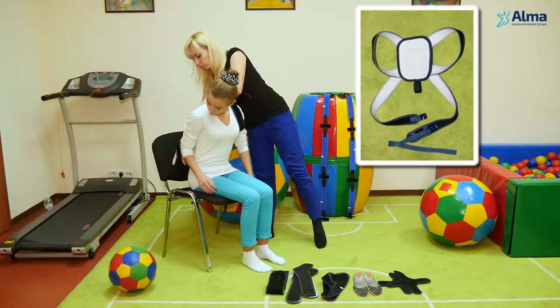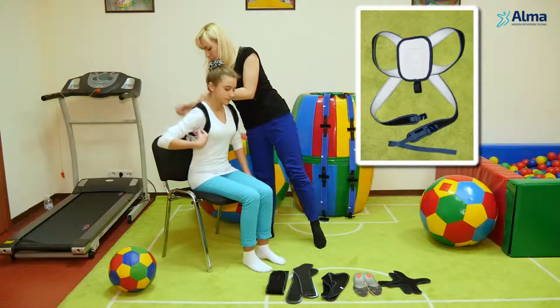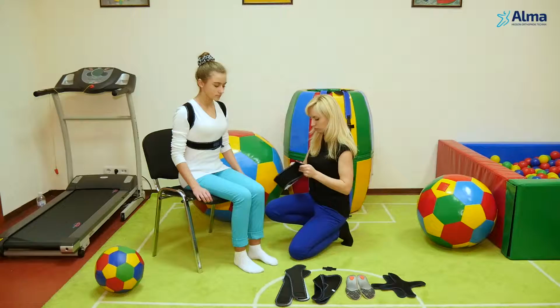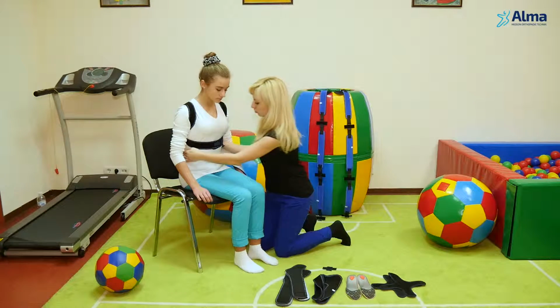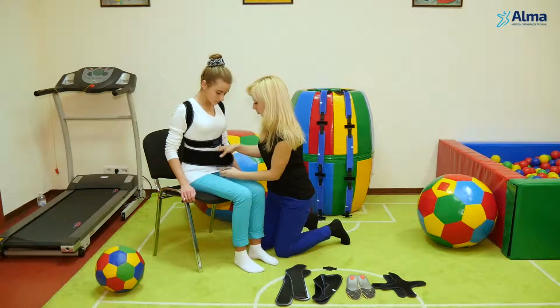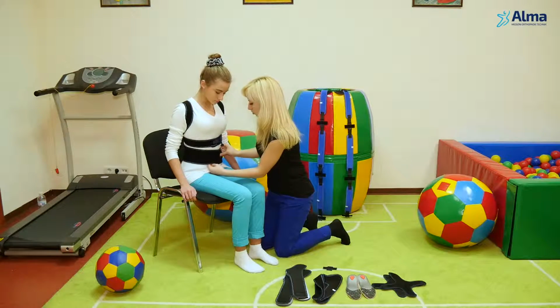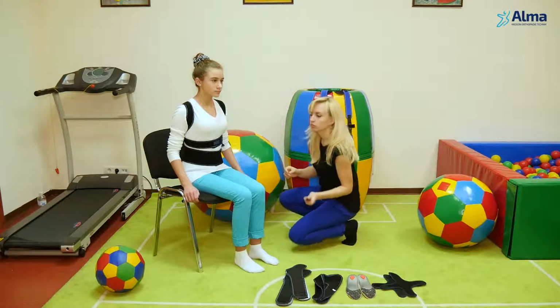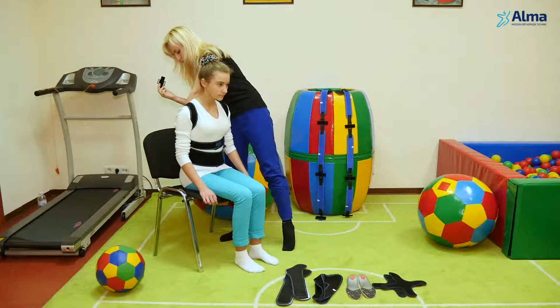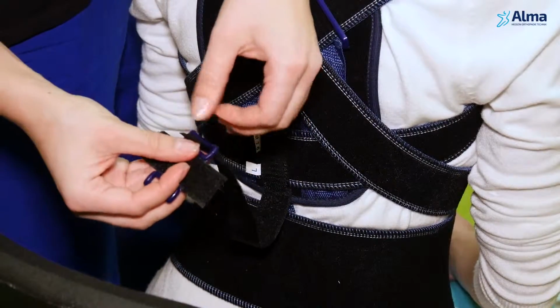When all basic mounting elements are selected according to patient measures and load chains are assembled, the patient can put the device on. First, basic mounting elements are put on. The first element to put on is the retractor, then the belt. For patient's comfort, basic mounting elements for lower extremities are put on when seated. Fasten the retractor to the belt.